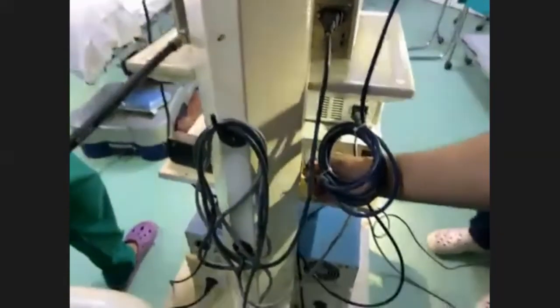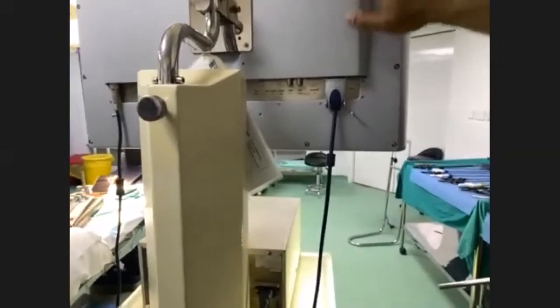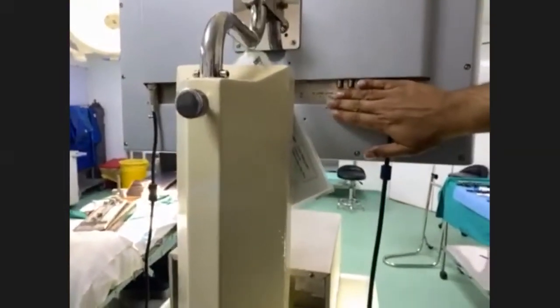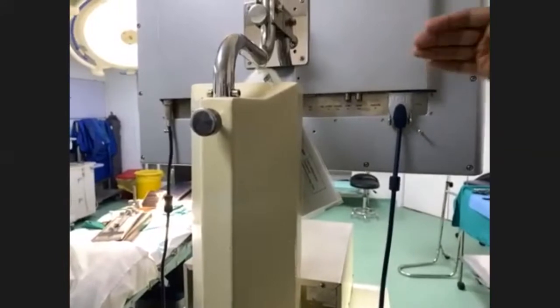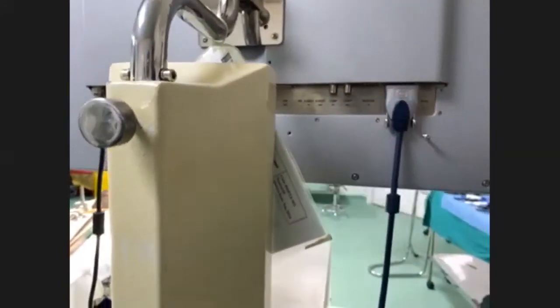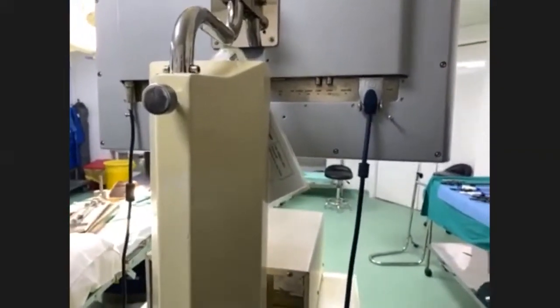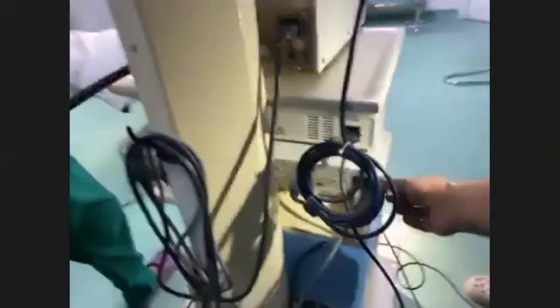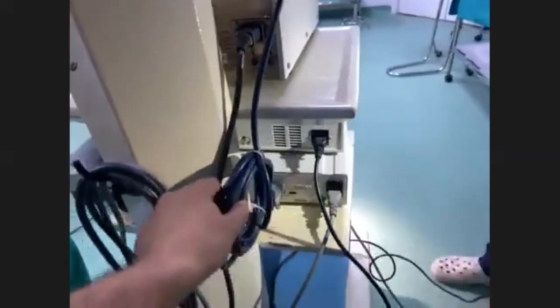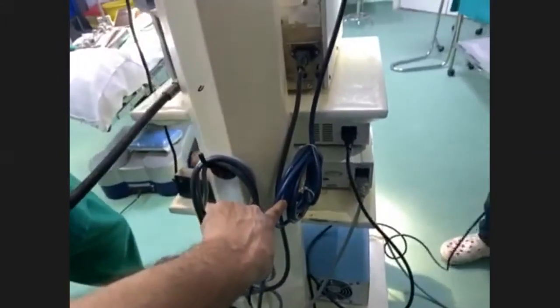is a system which is attached to the camera head, and the other knob, VGA, is attached to the LED. Then we have recording systems at the back and the outputs at the back and in the front as well. At the back here, there is the S video out, S video in, and on the front side, there is a USB port for recording as well. So we should know how to attach these with the power supplies, and they should all be attached to a good quality power supply unit at the back of the wall.